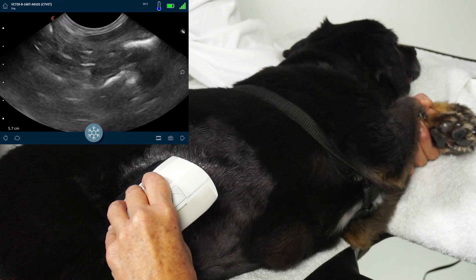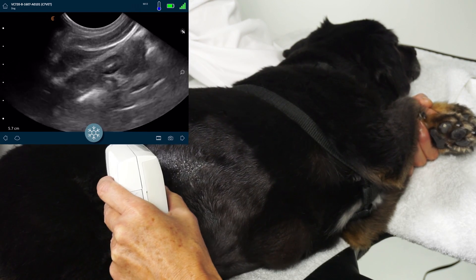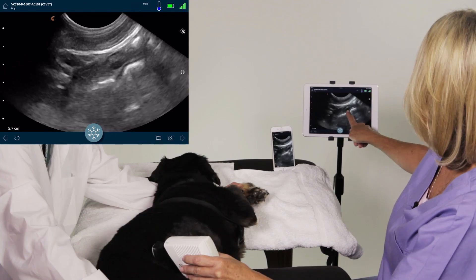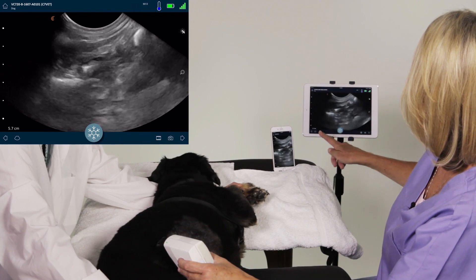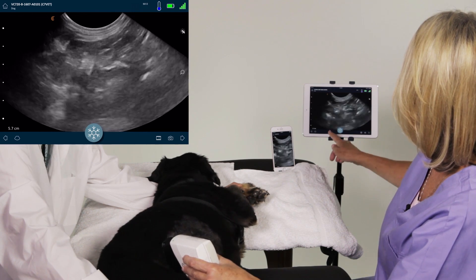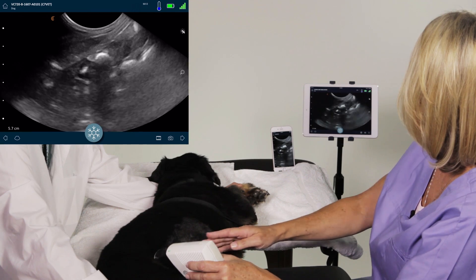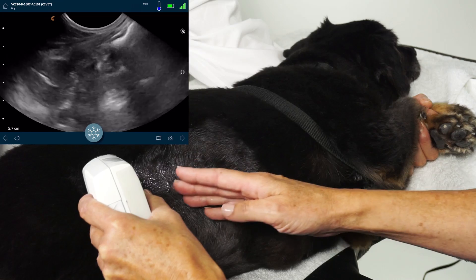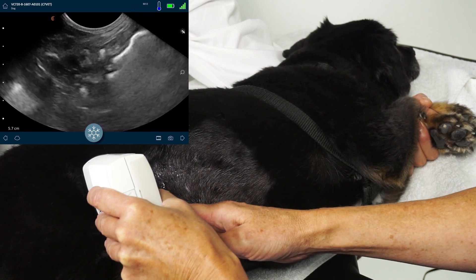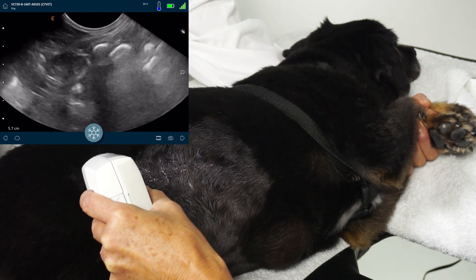And I'm going to rotate the transducer into transverse. And then I'm looking at this section of bowel right here — now it's in transverse. So I go all the way through it, and this is how you would interrogate the bowel. You want to make sure that you're going through the whole thing, following it. I'm actually following all the way caudally on the animal, and I'm looking for caliber size of the wall to make sure it stays relatively the same thickness.